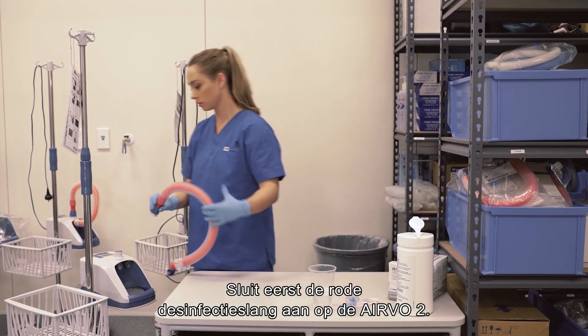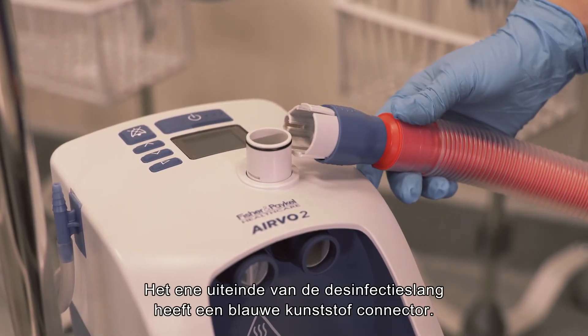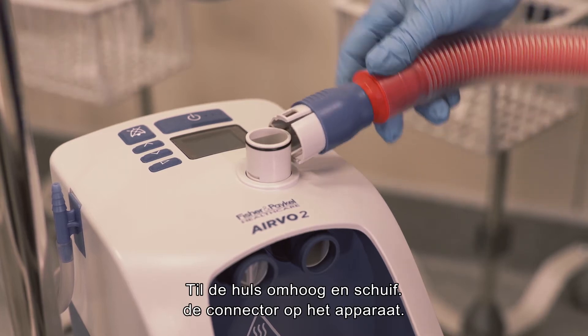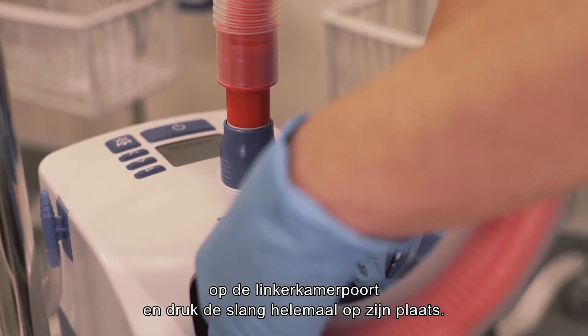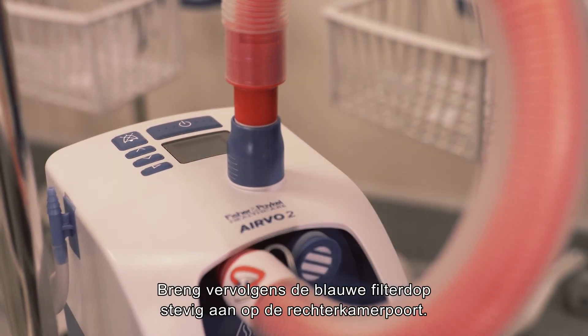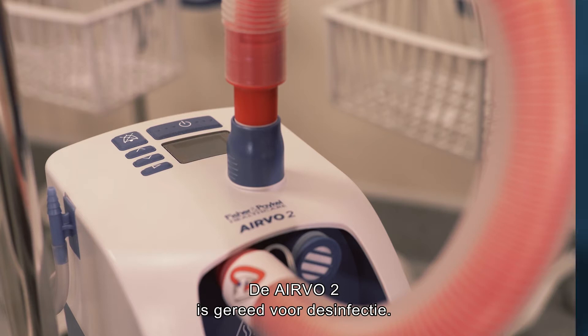First, connect the red disinfection tube to the AIRVO 2. One end of the disinfection tube has a blue plastic connector. Lift the sleeve and slide the connector onto the unit, then push the sleeve down to lock. Connect the red end of the disinfection tube to the left-hand chamber port and push fully into position. Then fix the blue filter cap securely onto the right chamber port. The AIRVO 2 is ready for disinfection.